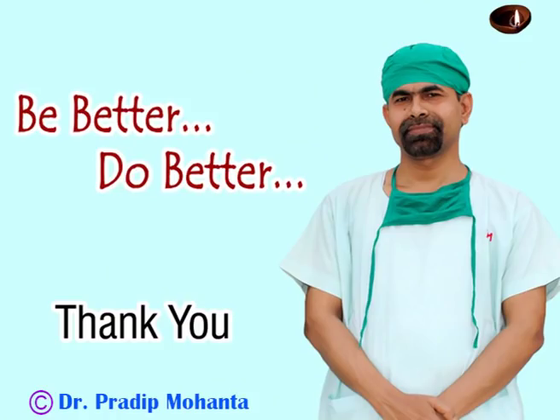Thank you very much for watching. I hope this video will help you in developing your surgical skills. Don't be afraid if hydrodissection is not good — employ this technique of no hydro FACO and you will be able to do a very safe surgery. Thank you very much for your attention.